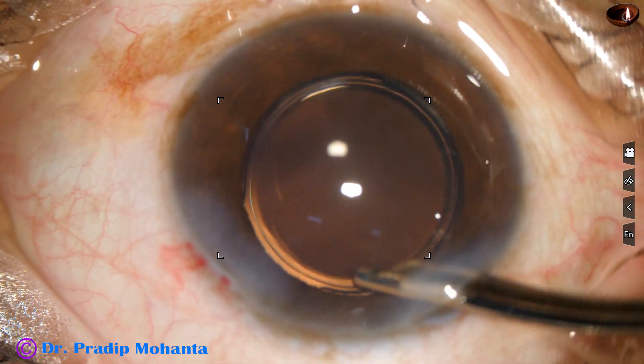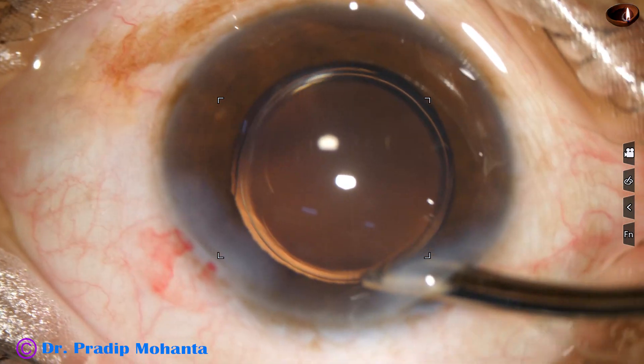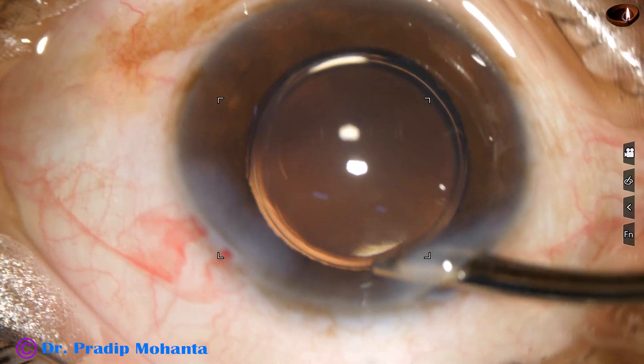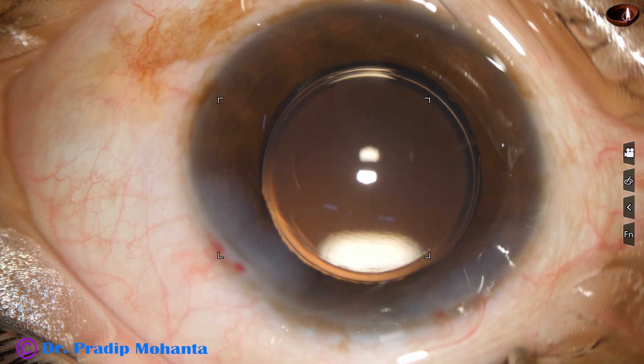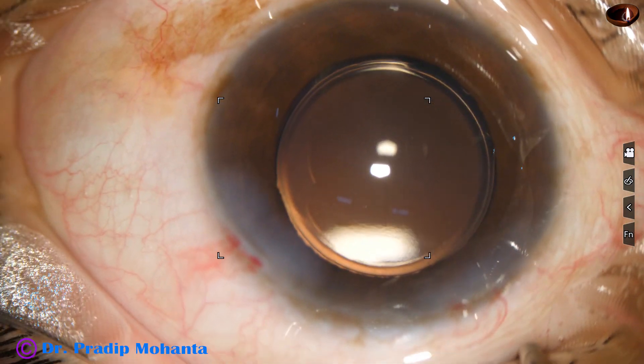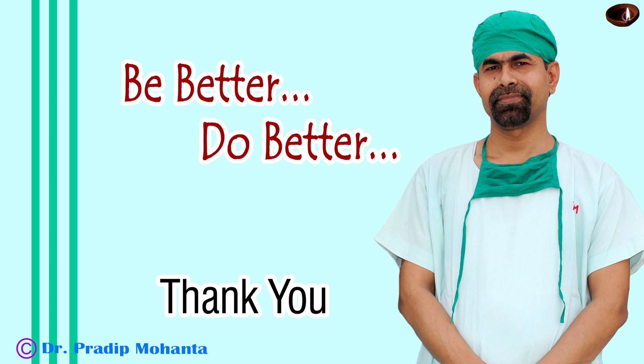The anterior chamber is nicely formed now, and then the integrity of the wound is checked and the case is concluded. Thank you very much for your attention. Hope this video will help you in developing your surgical skills. Be a great surgeon and serve your patients with love, respect, empathy, and great surgical competence.